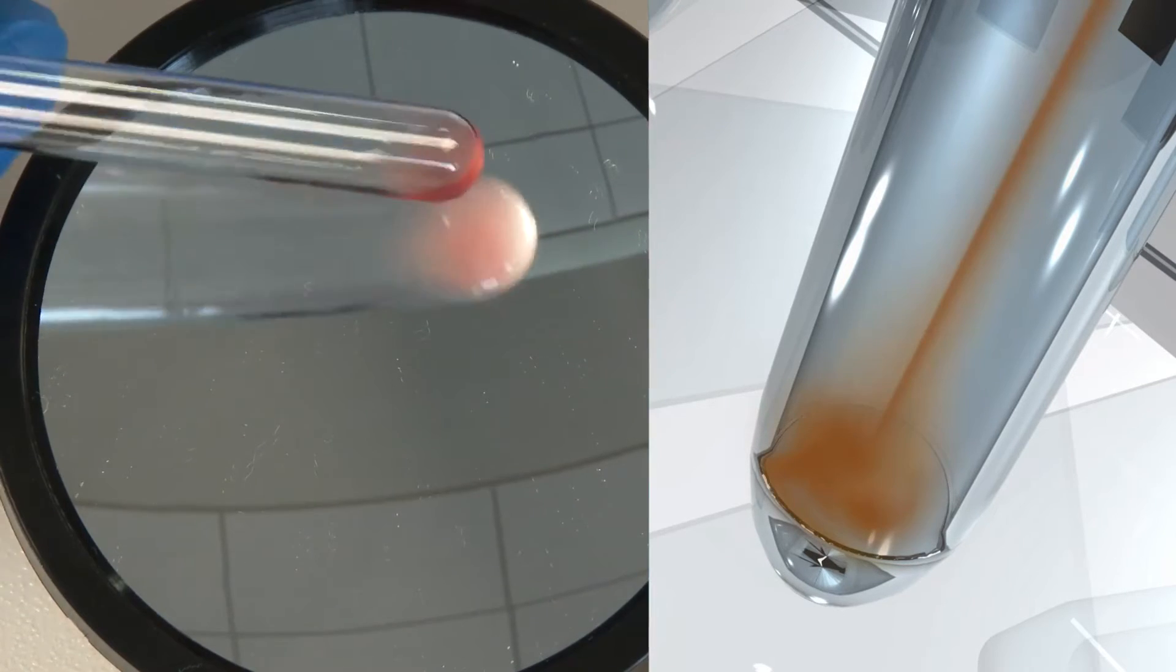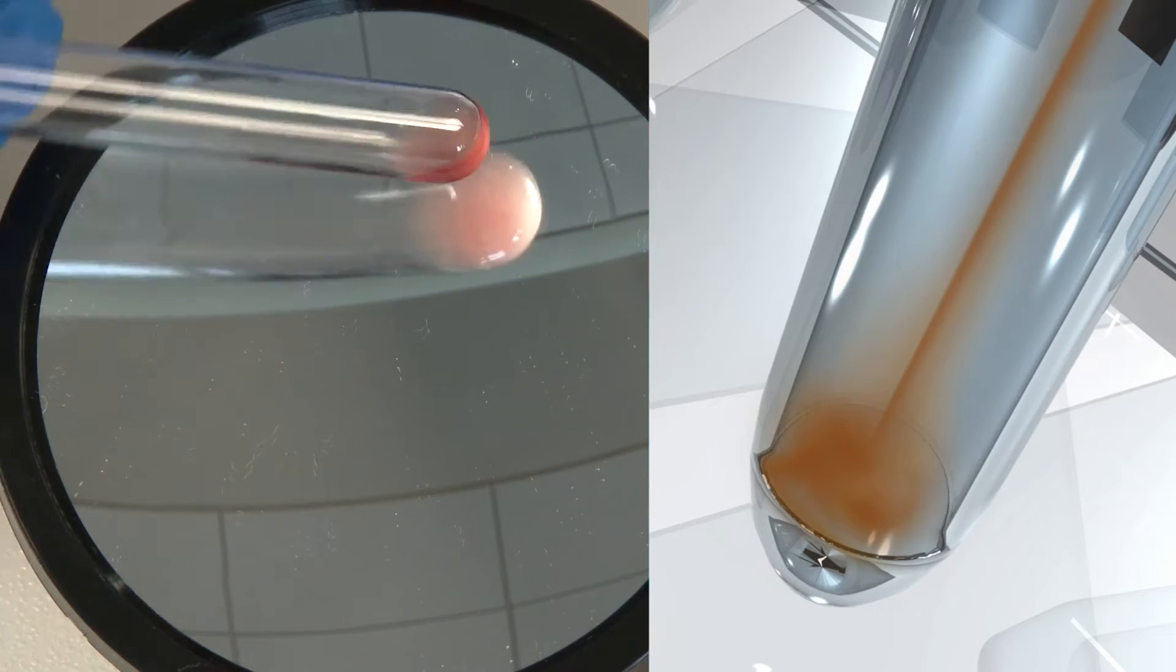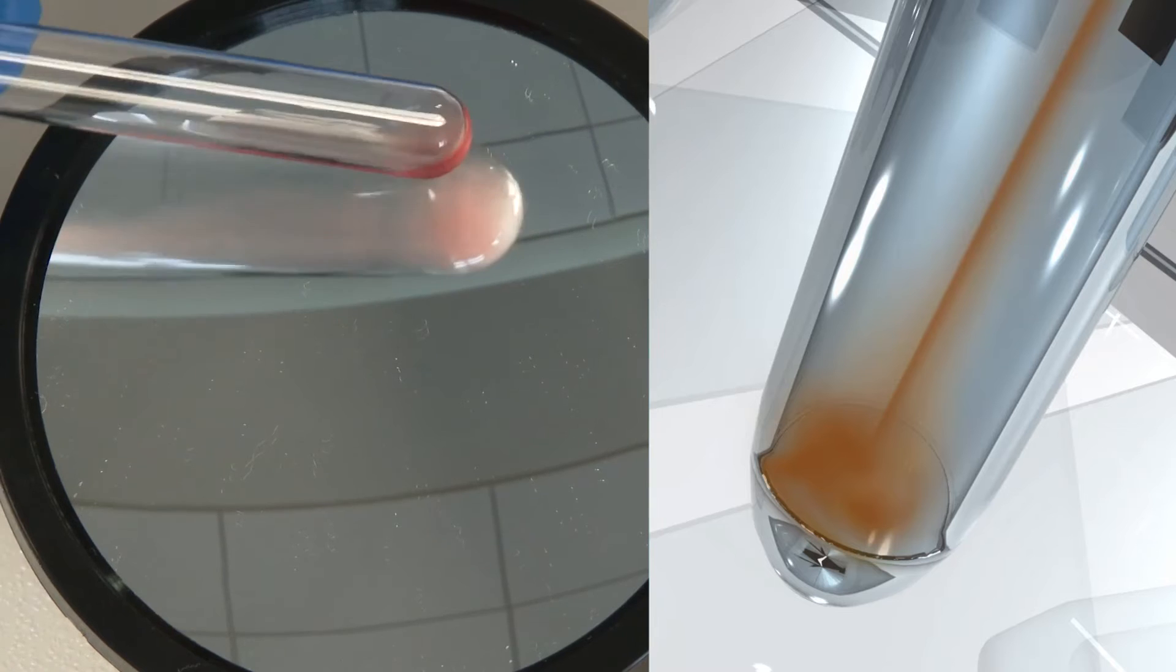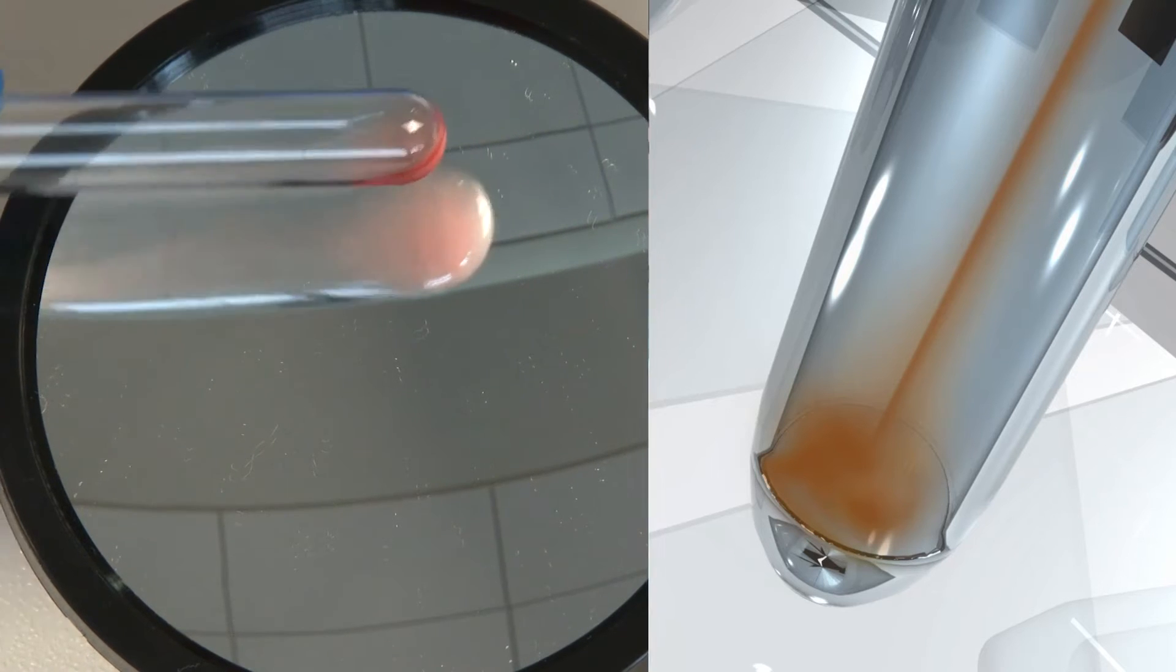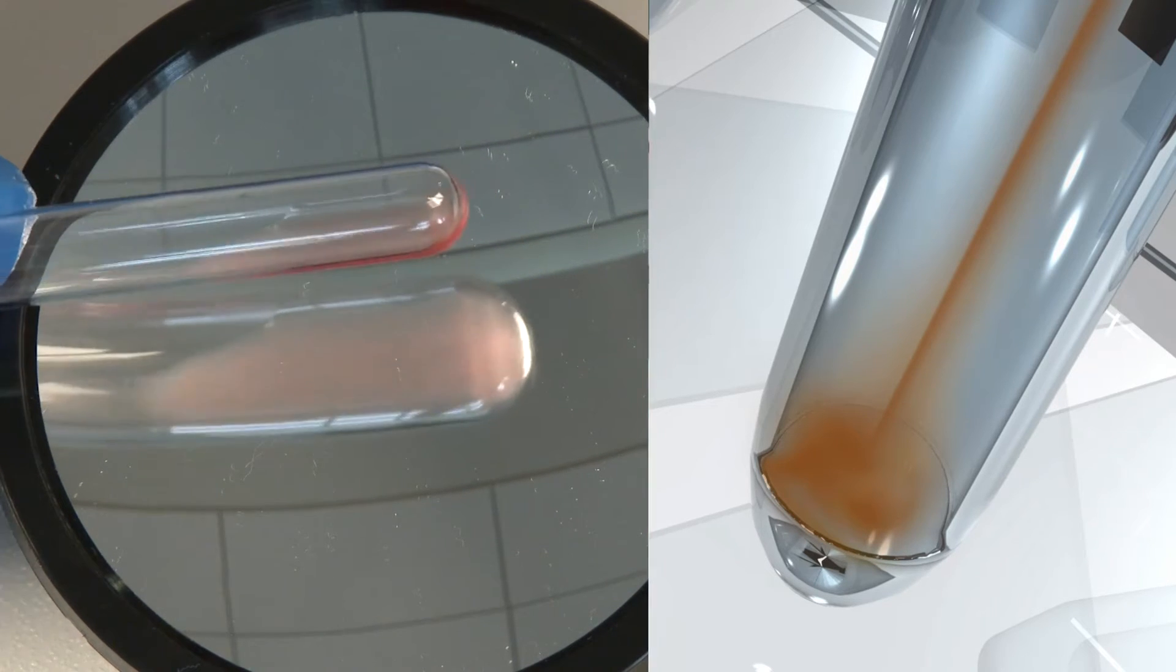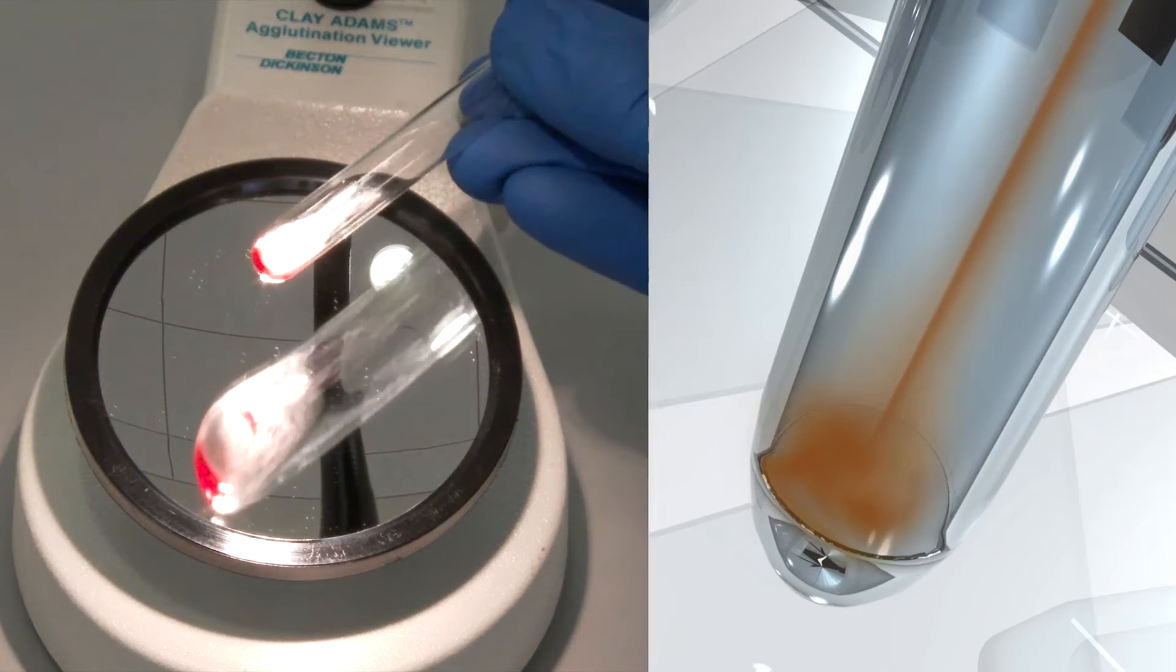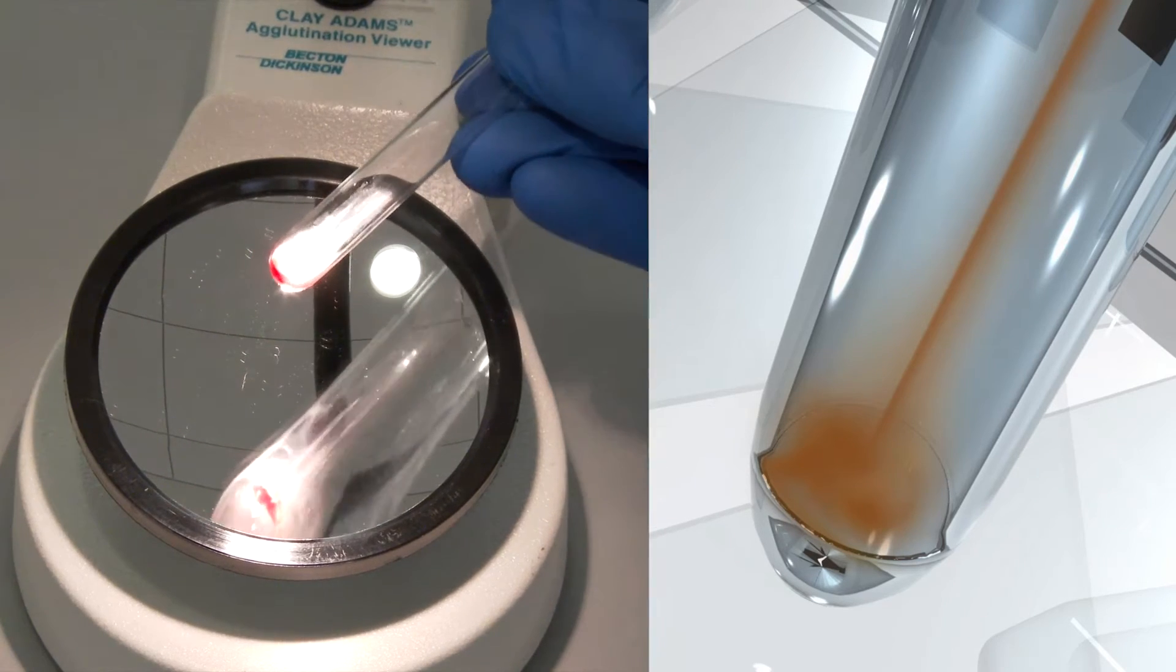A negative reaction is characterized by the appearance of an even cell suspension with no agglutinates detected. The cell button prior to rocking the test tube will demonstrate a smooth edge, and cells washing off the cell button while rocking the tube will often have a smoky appearance.